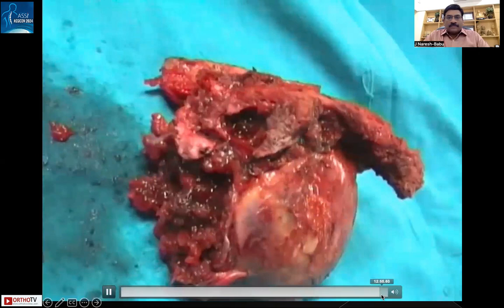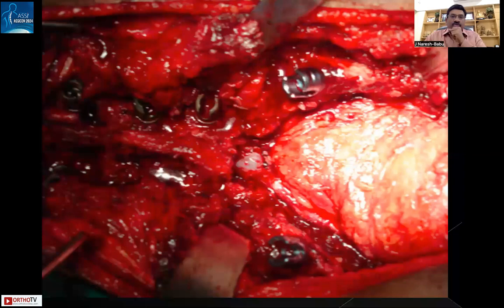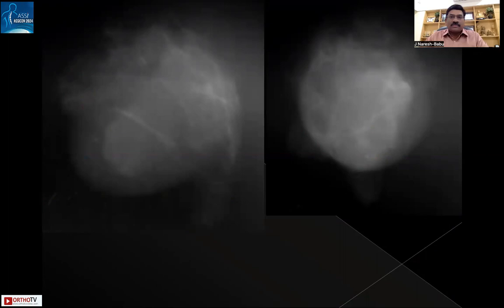This completes the total en-bloc sacral resection. At the end, a post-operative X-ray is taken to confirm the extent of sacral removal, and the post-operative picture with the sacral reconstruction is shown.